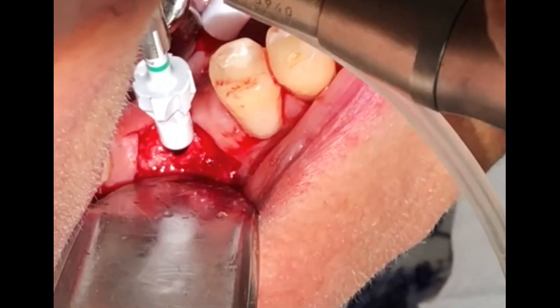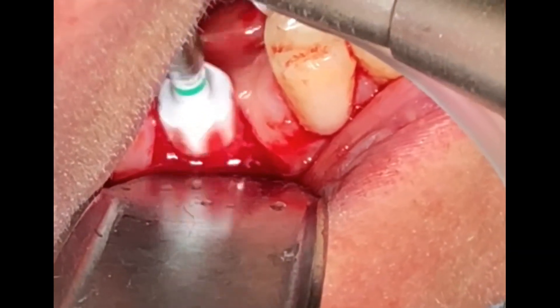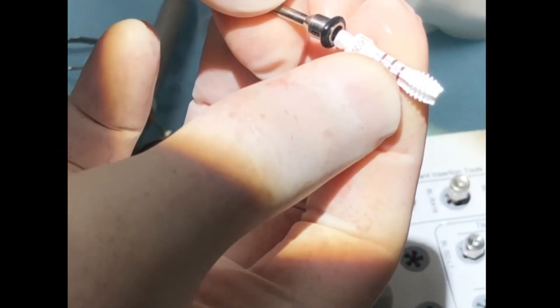This is the countersink drill, and always remember to lean it towards the thicker cortical slope, which in this case is on the lingual of the osteotomy.